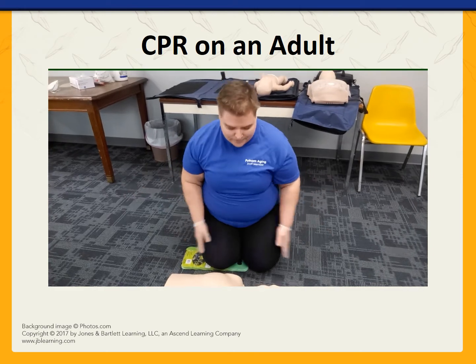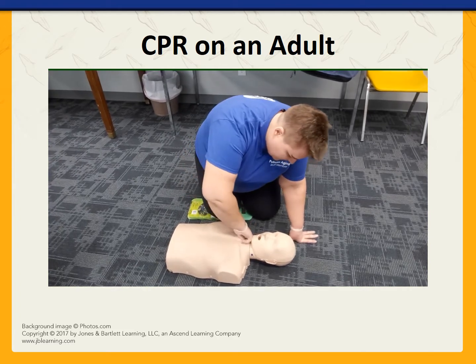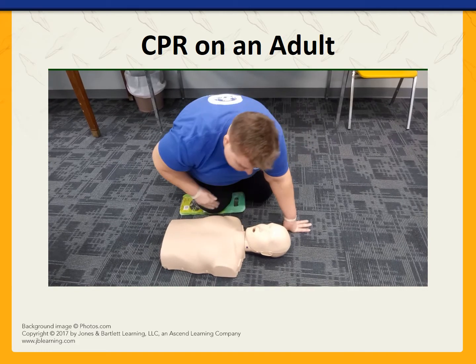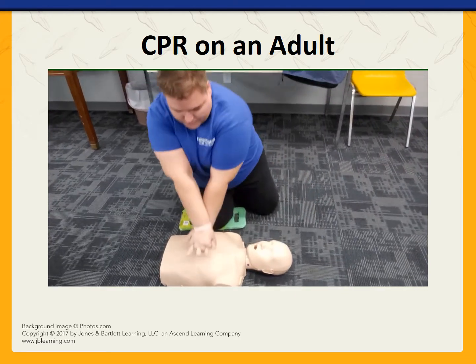Check the scene for safety, and now I'm going to confirm. Hello, can you hear me? Not answering. Checking for a pulse on the carotid artery. Not feeling one. Checking for breath and watching the chest to see if it rises or falls. I don't see it, so going into my compressions.